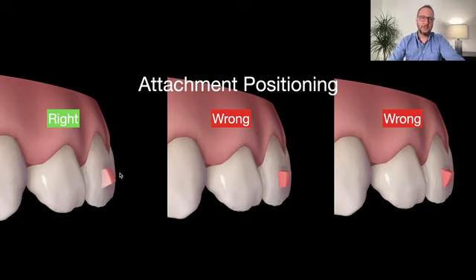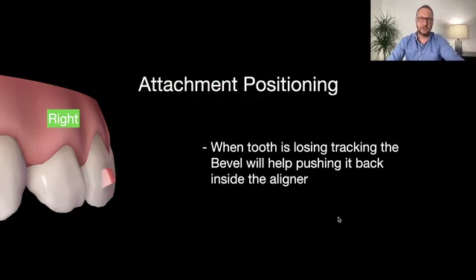And then I'm going to show, I believe in the next slides, how to keep the aligner in position, well seated with a good tracking. It's easier here than here, because with the minimal movement of the aligners out, we're going to have this surface, this ramp, moving the plastic even more down, okay? But let's show some images for you to understand, okay?